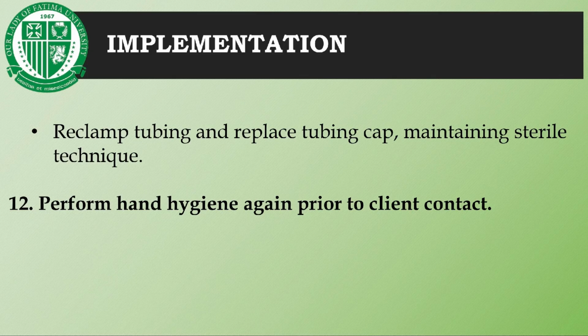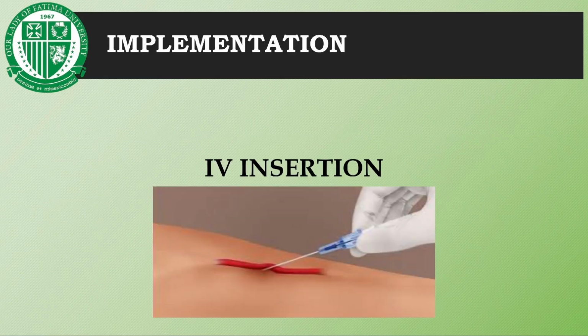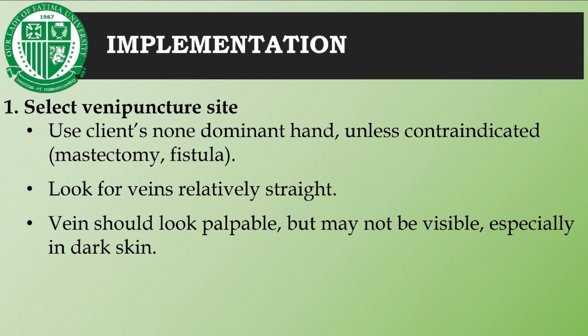And lastly, perform hand hygiene again prior to client contact to reduce the risk of cross-contamination, sustaining the principle of infection control and patient safety. Next, let's talk about how to safely and effectively insert an IV. First is to select a suitable venipuncture site.